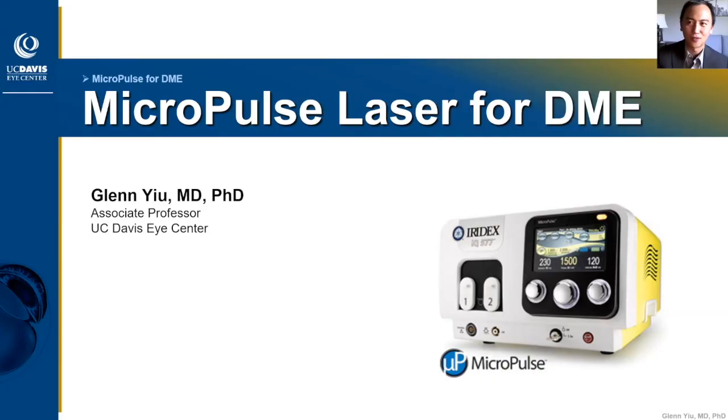Thank you for the introduction. It's interesting that Dr. Calzada was talking about how he would like to treat over the area of edema as well as the areas of leakage. Personally, I often treat over the entire macula because I do believe in the mechanism of action. I don't see any damage at all. We do multimodal imaging, autofluorescence, infrared. I actually don't see any indication of pulse laser treatment causing any damage. And in fact, if the concept is to upregulate these heat shock proteins in a more neuroprotective manner, I find that a broader area of treatment is often useful. So I like to treat over the entire macula.